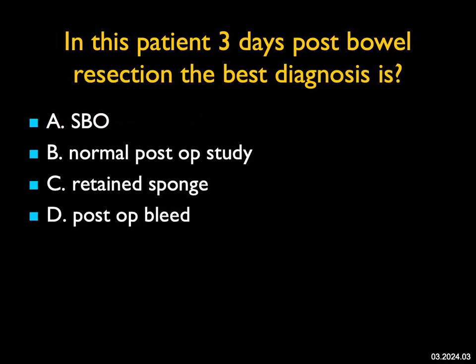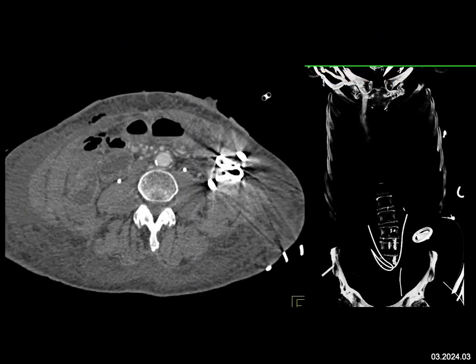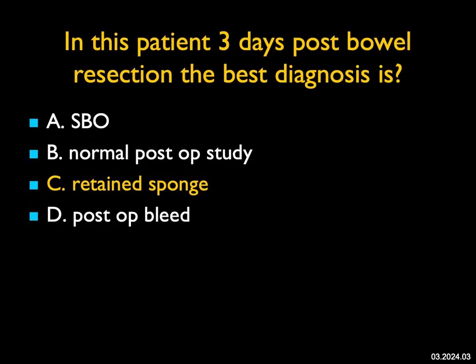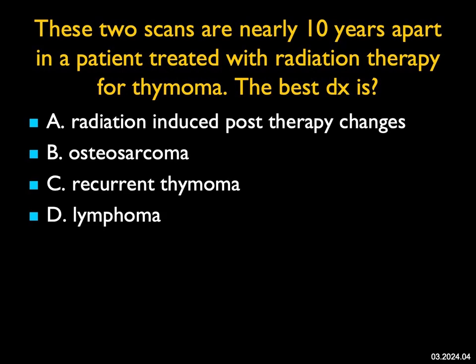In this patient three days post bowel resection, the best diagnosis: I don't see a small bowel obstruction, and it's obviously not a normal post-op study. I don't see a bleed, but I see what looks like some foreign matter — high-density material — in the left lower quadrant. On the MIP coronal or MIP topogram you can see some drains in place, but in the left lower quadrant there's high-density material. This is a retained sponge. Retained sponges still occur and the radiologist needs to recognize it; the patient required a second surgery.